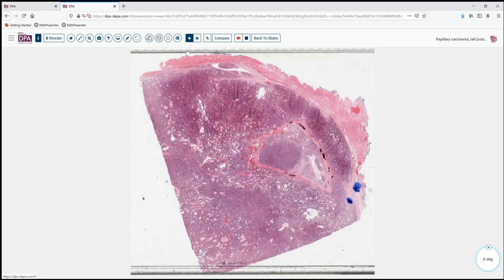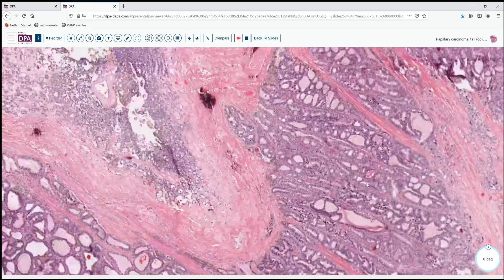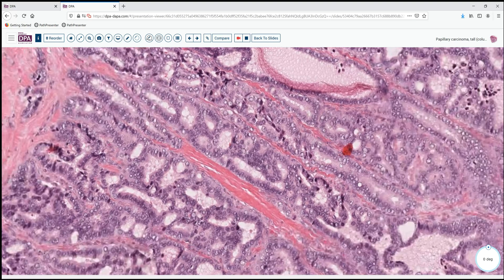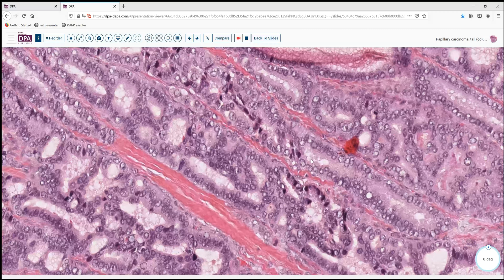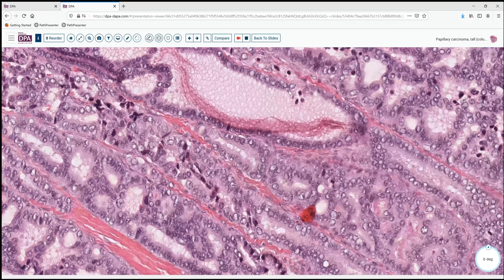Let's take a quick look at an area that we felt was representative of the columnar cell variant. We can see that in this particular area the cells are a little bit on the tall side, but they're not quite two to three times. There's a lot of papillary fringe on some of these, but they're not quite that tall. And we don't have quite the same frequency of nuclear inclusions. We've got some, but we don't have them quite as cleared out as in our previously examined case. Certainly these are papillary carcinoma features, but there are no papillary structures here, and we have this columnar pattern without the really tall, two to three times cytoplasmic features.